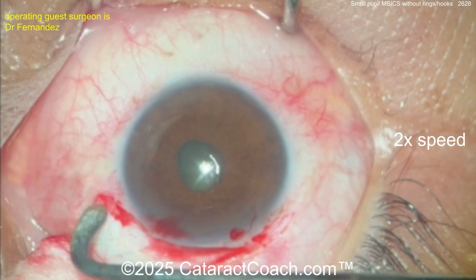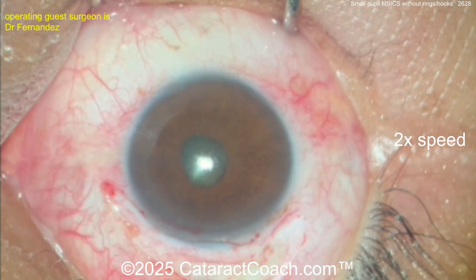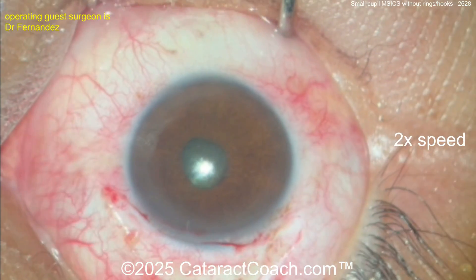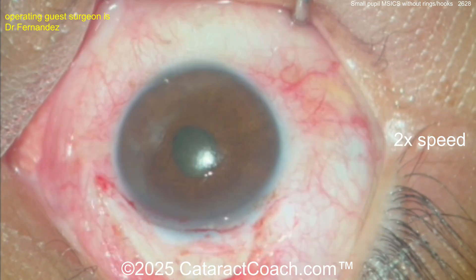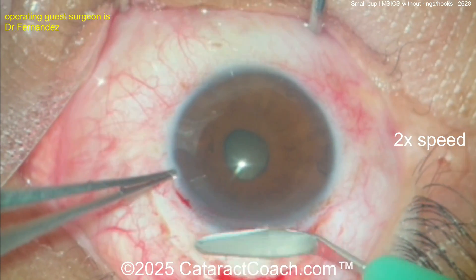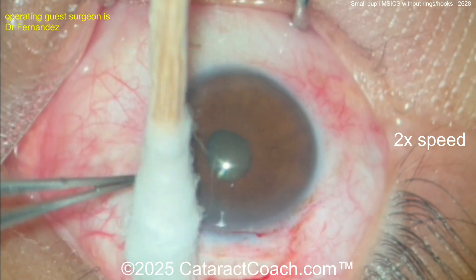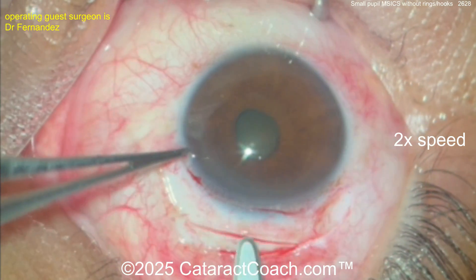Now the key to the whole surgery is the incision. After the cautery is done, we make the incision. The key is it's a shelved incision with a long tunnel length — not like the old days of manual ECCE, the extracapsular cataract surgery done with corneoscleral incisions. You can see there's a little bit of a groove at half scleral depth only.